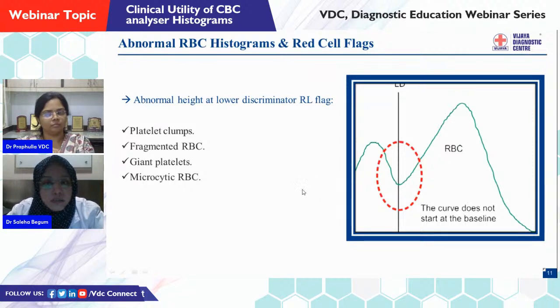So the causes. Such graphs give a signal as an RL flag in the CBC report, and causes of such RL flagging are platelet clumps, fragmented RBC, giant platelets, microcytic RBC, meaning that there are some particles which are present in significant numbers, which are lesser than the usual detection limit of an RBC graph.